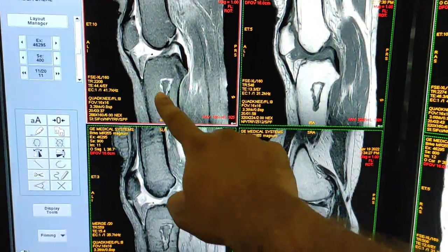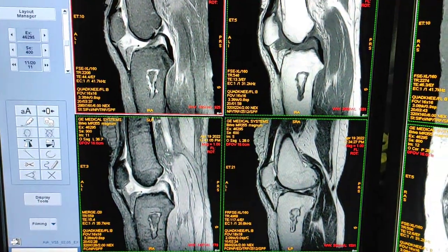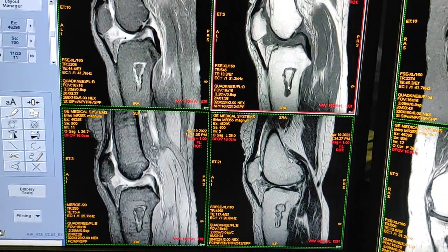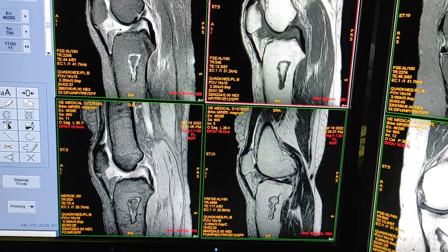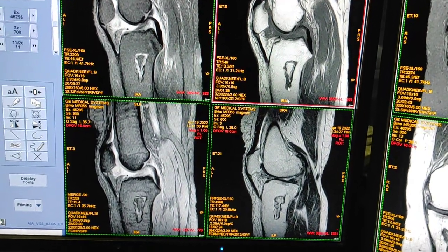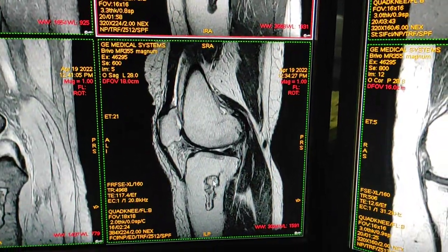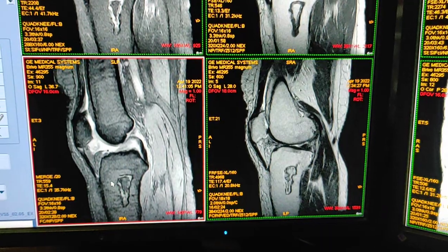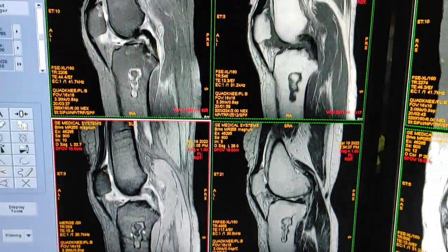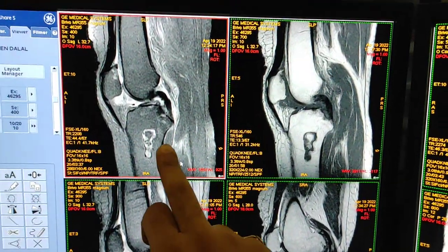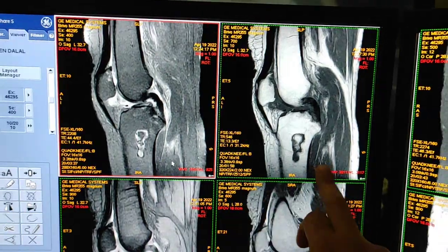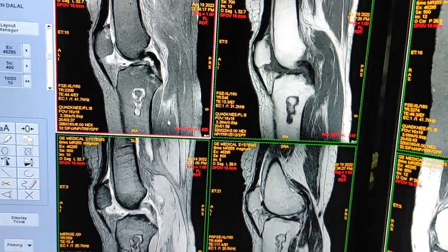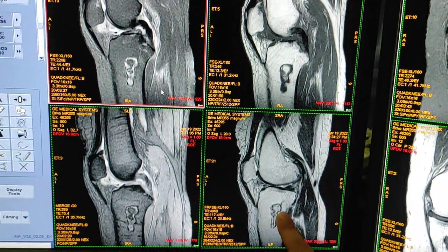You can see this lesion — it is hyperintense on the fat-sat PD image. You can also see a hypointense rim on the T1 weighted as well as on the T2 weighted images. This is the gradient GRE sequence. Again, this is fat-sat PD, this is T1, and here is the hypointense rim — the same hypointense rim on T2 weighted.